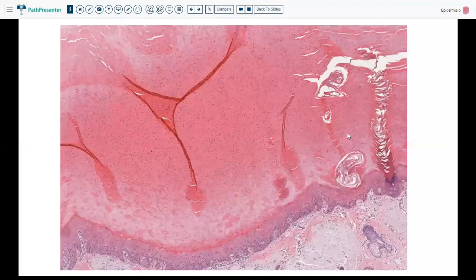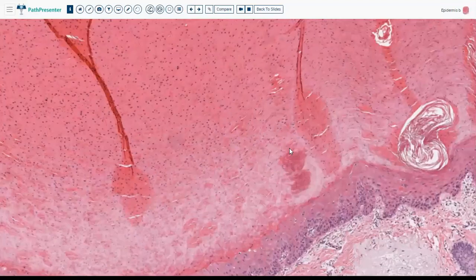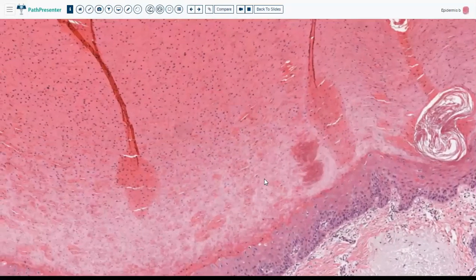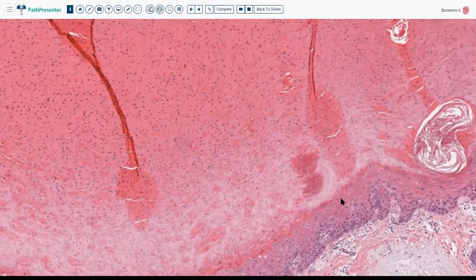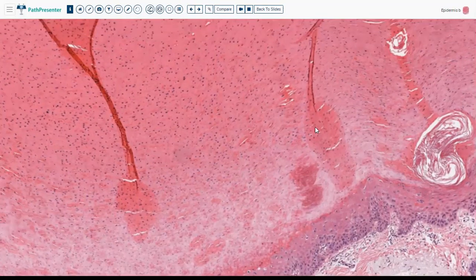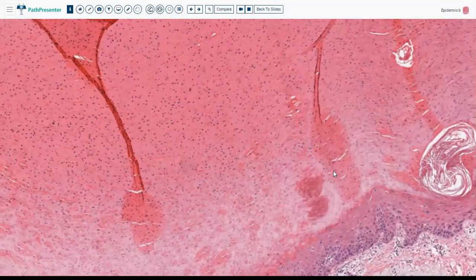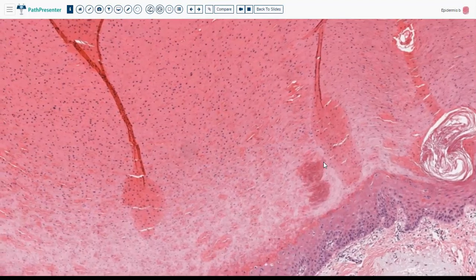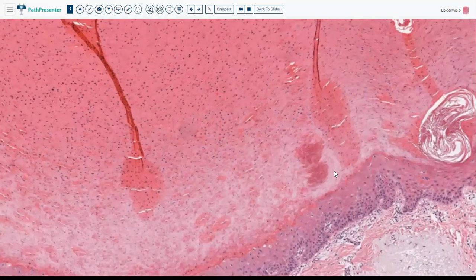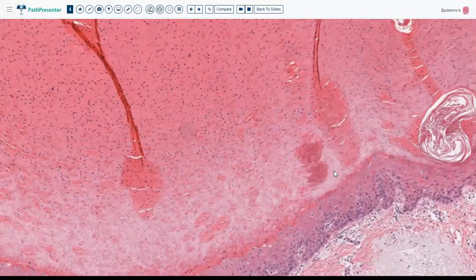The next slide discusses pretty much the same thing in terms of parakeratosis, but it's an important example showing that there's more than one mechanism. The first mechanism is inflammatory — the cells go up so fast. But in this case of actinic keratosis, you can see confluent parakeratosis. The problem here is not that the cells are going up faster — they go more or less the same speed — but because it's cancer, the cells just won't die. So that's another mechanism of parakeratosis: cells that basically refuse to die.